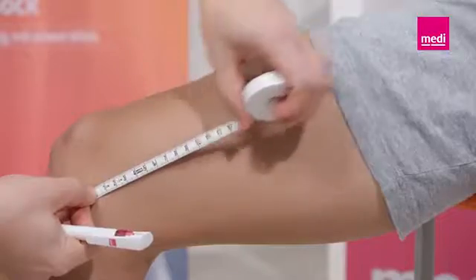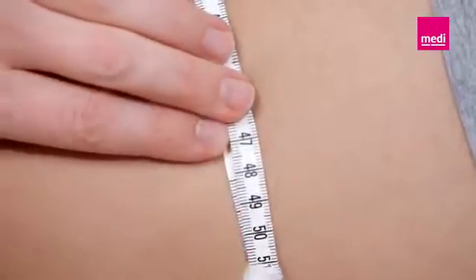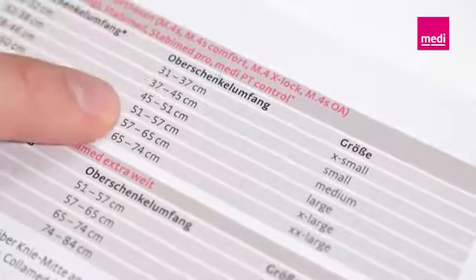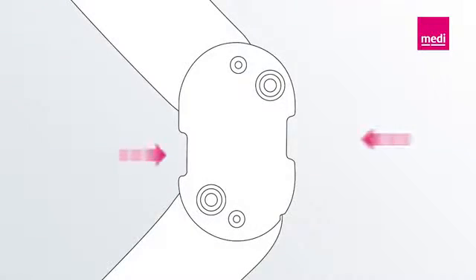To determine the right size of the orthosis, please measure the circumference of the affected leg 15 centimeters above the middle of the knee joint on the medial side. Then you can select the suitable product from the size chart. The orthosis can now be adjusted.